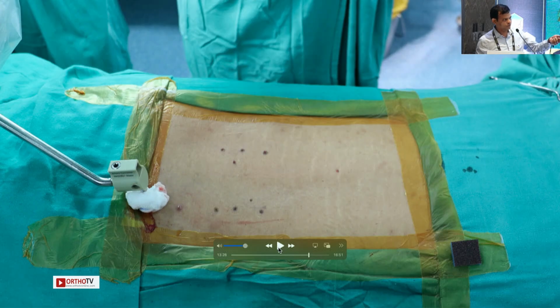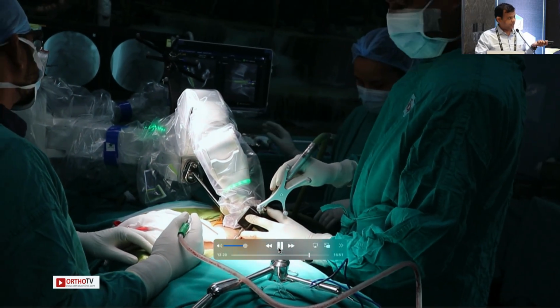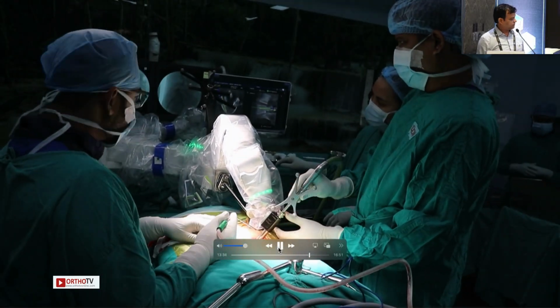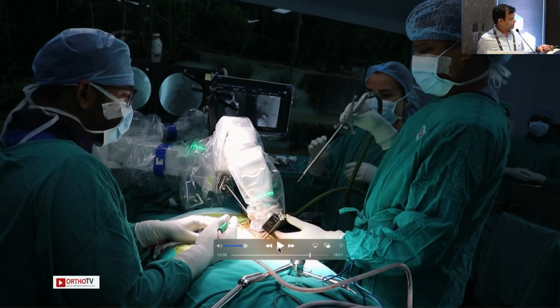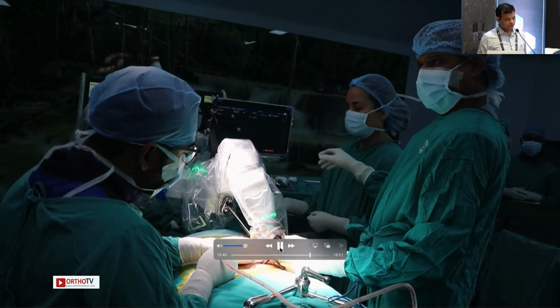You want to comment something? Yeah, I think this is one of the advantages not many people talk about, that you can plan your incisions. Everything can be planned. So this is the stage where I enter, and now we are drilling, and drilling just takes 15 seconds for each screw. This is the sleeve, and you have a dilator. You have to use this drill, because this one doesn't cause skiving.